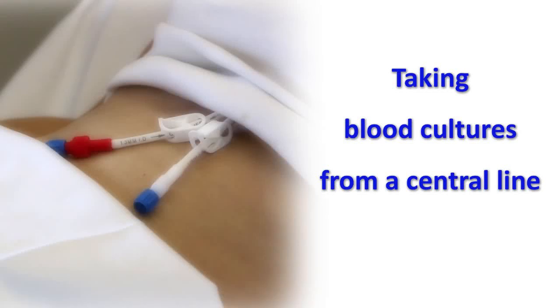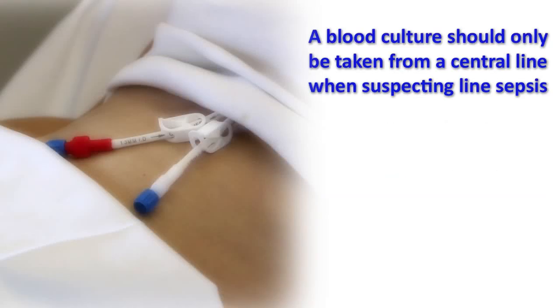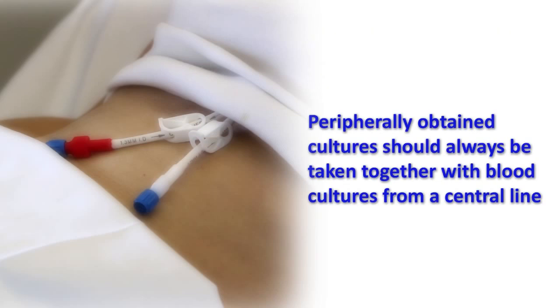Taking blood cultures from a central line. A blood culture should only be taken from a central line when suspecting line sepsis. Peripherally obtained cultures should always be taken together with blood cultures from a central line.